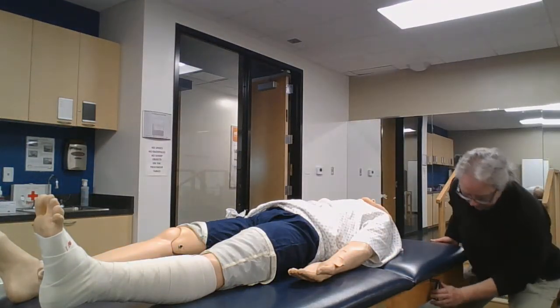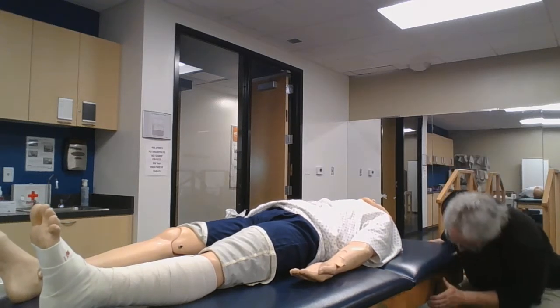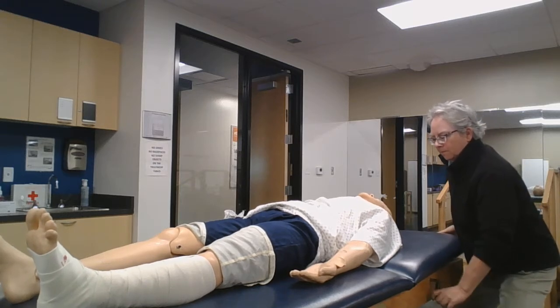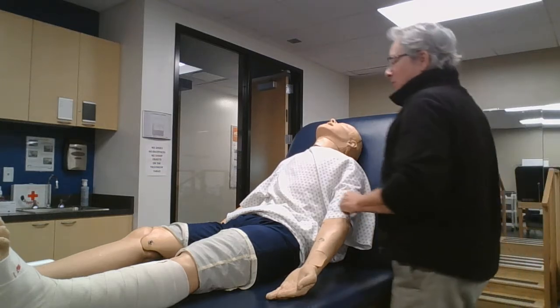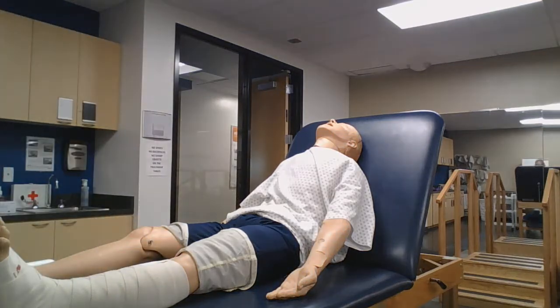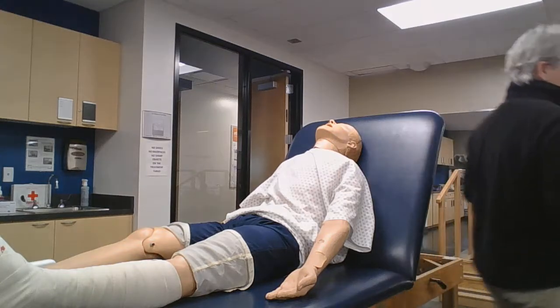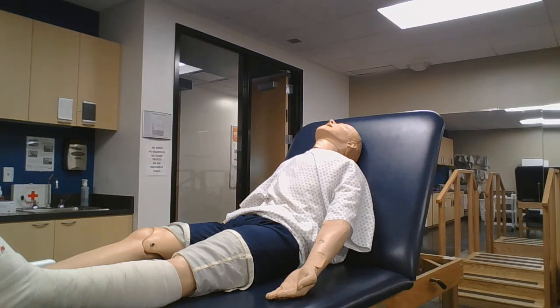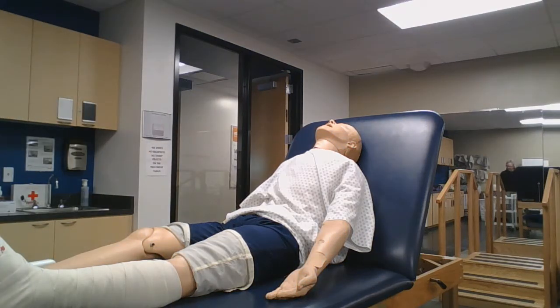Joe is telling me, good body mechanics here. Usually the patient would be able to come up and go into some flexion of his trunk using his abs, but Joe cannot. So, all right. We would want a pillow or something behind Joe here. Okay, so you guys, that is ACE wrapping.